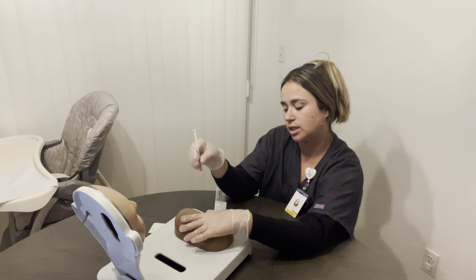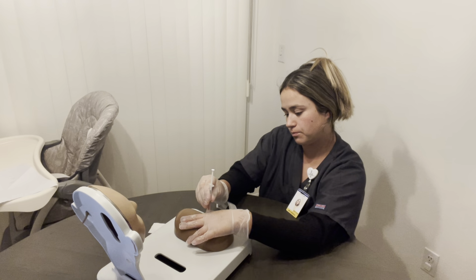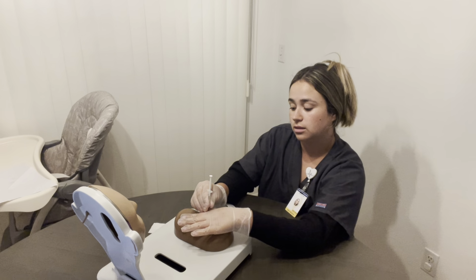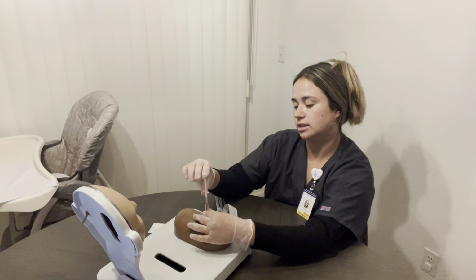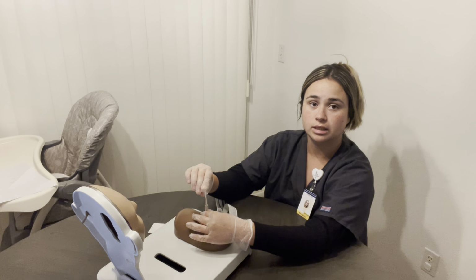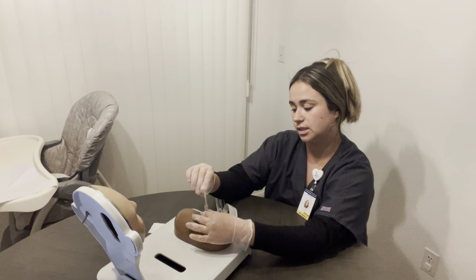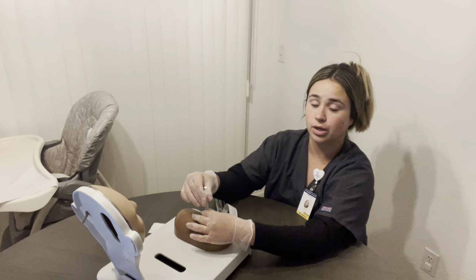Ms. Smith, I'm going to go ahead and inject the medication now, okay? 1, 2, 3. Okay, now I'm going to get a good grip with this hand. And I will inject the medication. Once it's injected, we want to wait 10 seconds to remove it, okay? 1, 2, 3, 4, 5, 6, 7, 8, 9, 10. Once the 10 seconds is up, then we can go ahead and remove it.